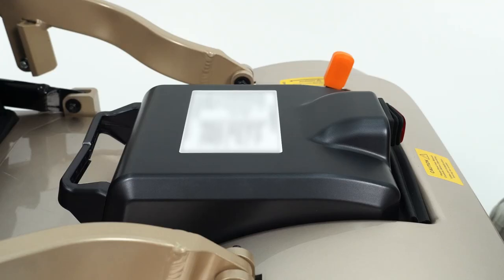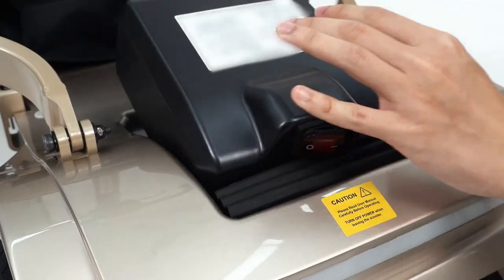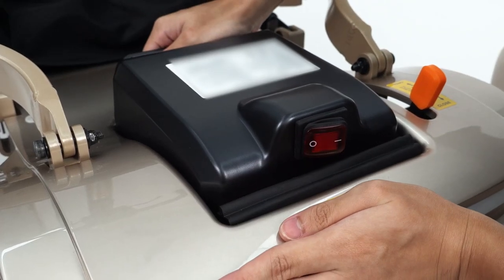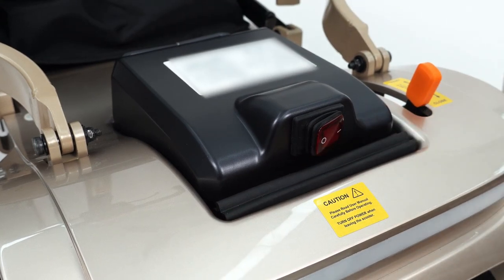Detaching the battery: First, make sure the power switch is off. Using the battery handle, push the battery in and lift it. To attach the battery, slide the battery in and push it down. Now switch the power back on.